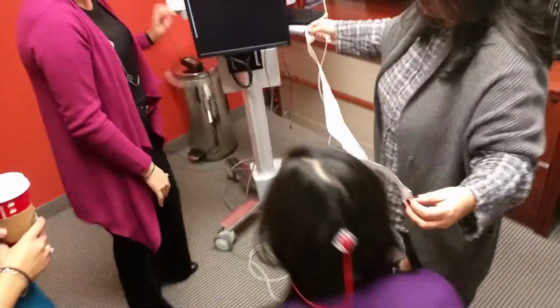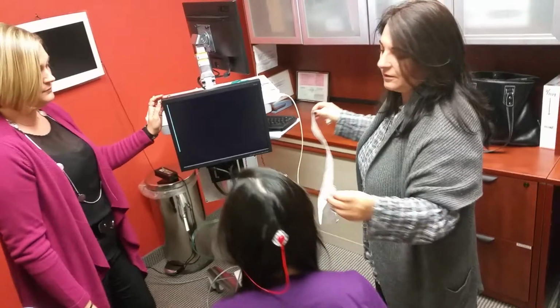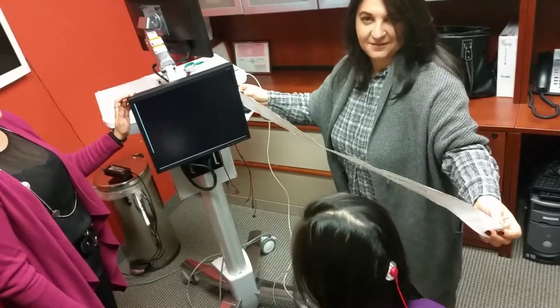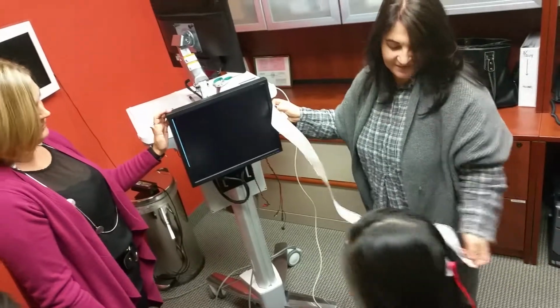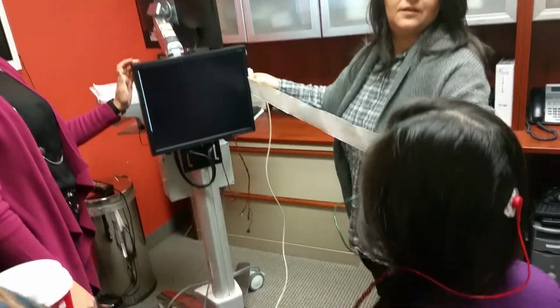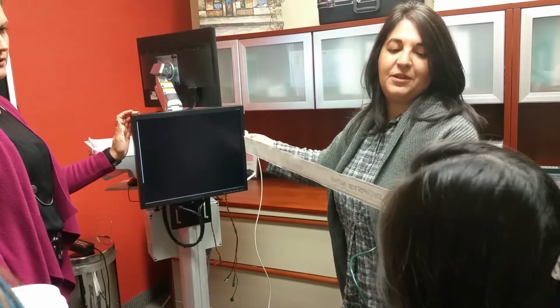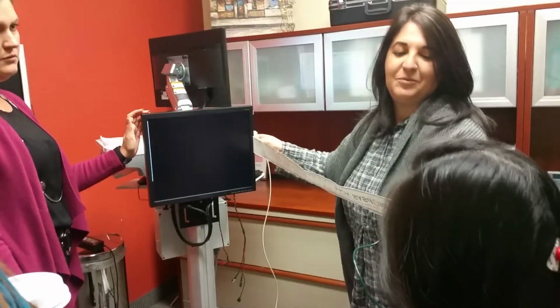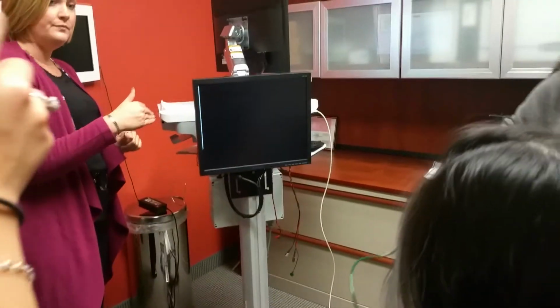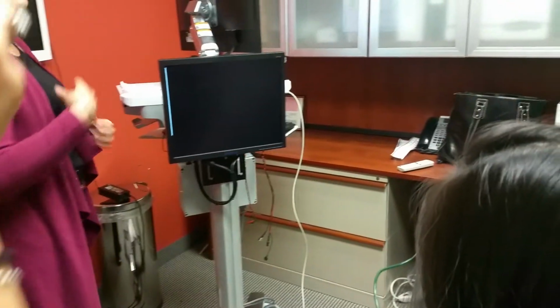So we need you to sit up in your chair. Make sure that you're nice and level. Okay, let me just lower this. I think this is over it, or? You should be fine. You should be eye level. Okay, scoot back a little bit. Just stay here. Perfect. Yeah, that's good. Okay. So then, do you feel like you're nice and centered with the screen? Okay. So let's hand her that occluder over there.